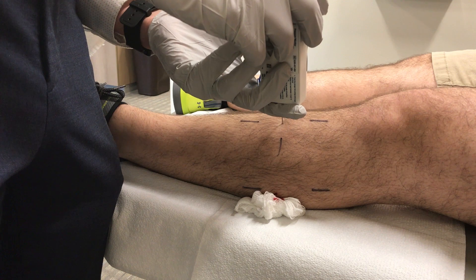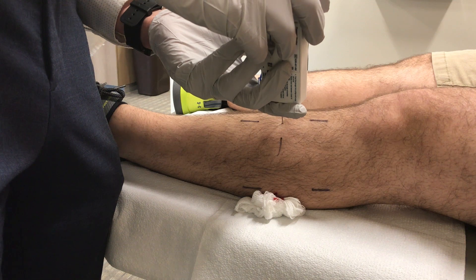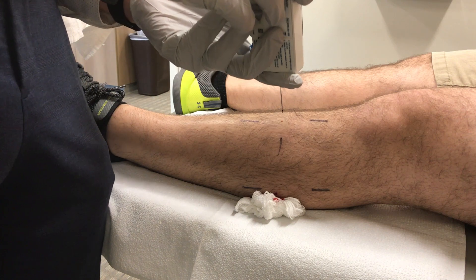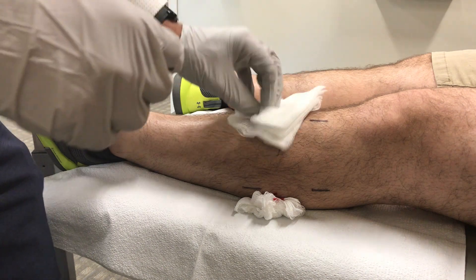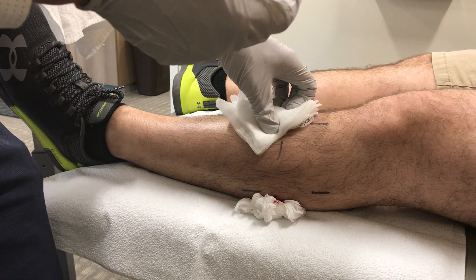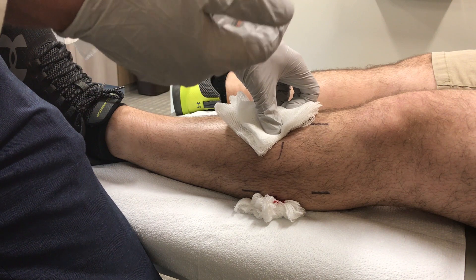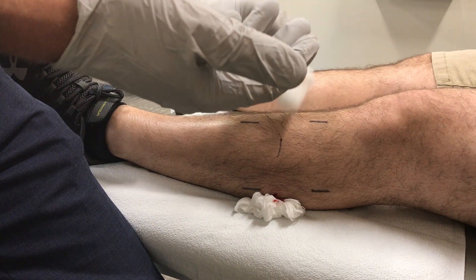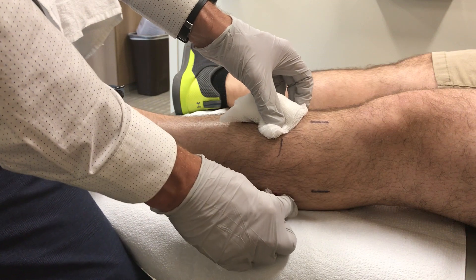The anterior compartment usually shows the highest levels, and here it settles at about 16 mmHg — which is borderline for a pre-exercise test. After that, we'll have the patient exercise on a treadmill until they reproduce their symptoms from running or hiking, then retest at one and five minutes post-exercise.